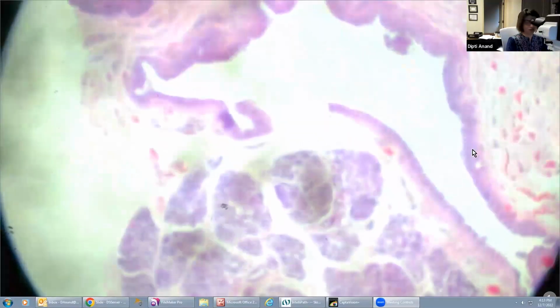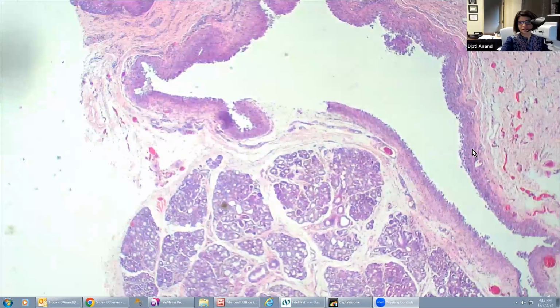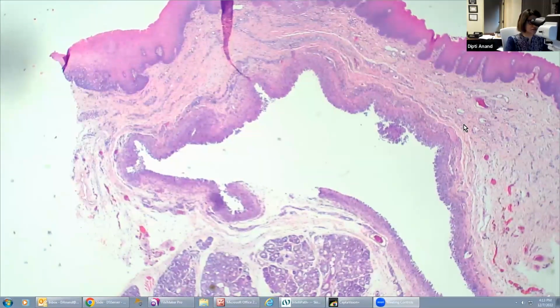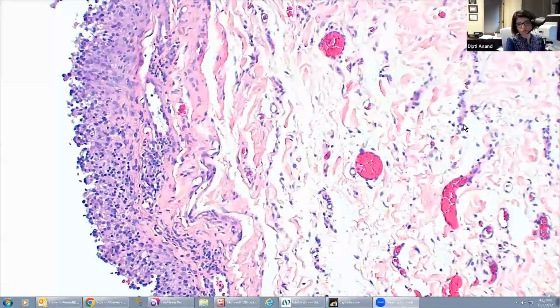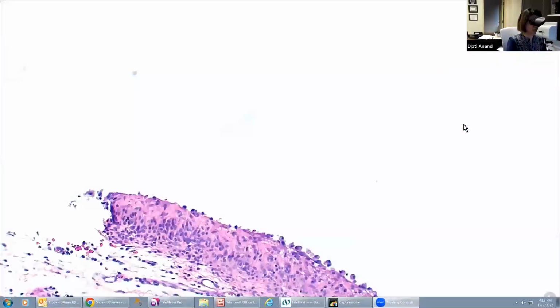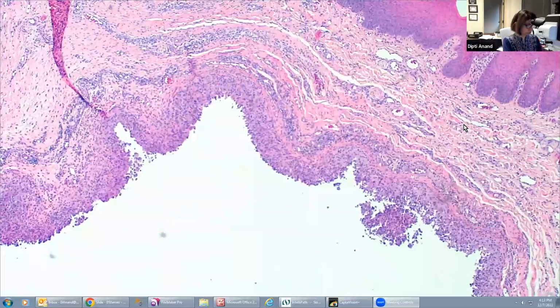This is the kind which I'm saying may be a little bit more challenging, where you do not see the mucin. But sorry, I don't know why I'm having problem focusing the slide. So you can again see the mucosal epithelium, the salivary gland tissue, and now you see here a big empty space with no mucin. That's because the mucin is inside the histiocytes. So all these inflammatory cells are actually muciphages, which have taken up the mucin inside them. So if you were to do a stain, it would actually highlight the mucin inside these histiocytes, but you actually don't see any mucin within the space. So that, again, is another type of a mucocele.